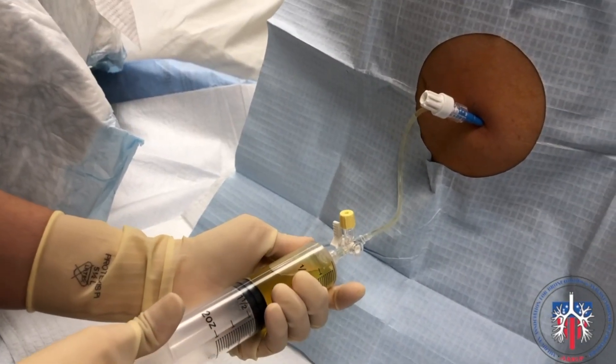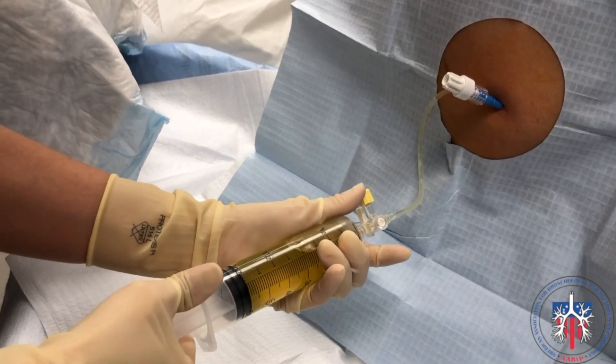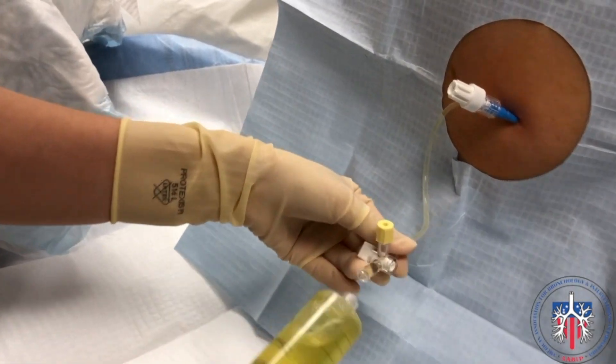Attach the syringe onto the three-way stopcock at the end of the tubing. You can then pull fluid for studies. Remember to close the stopcock toward the patient to prevent air entry before the syringe is removed.